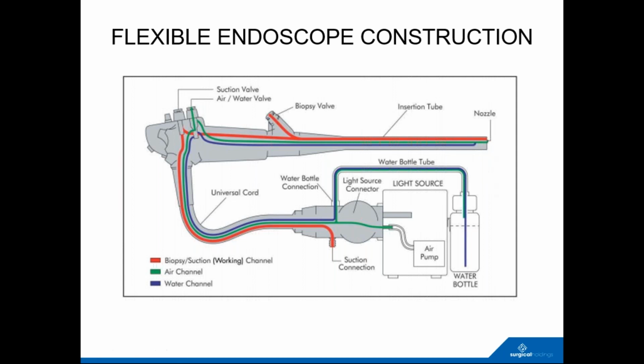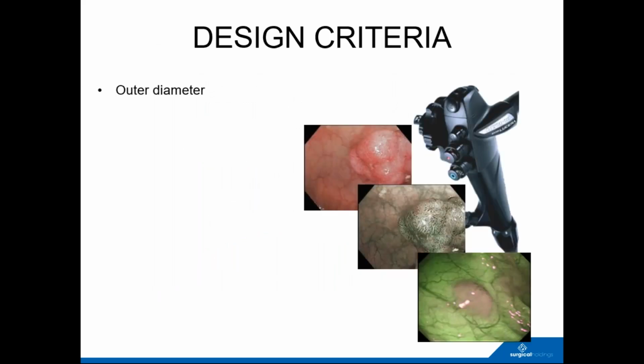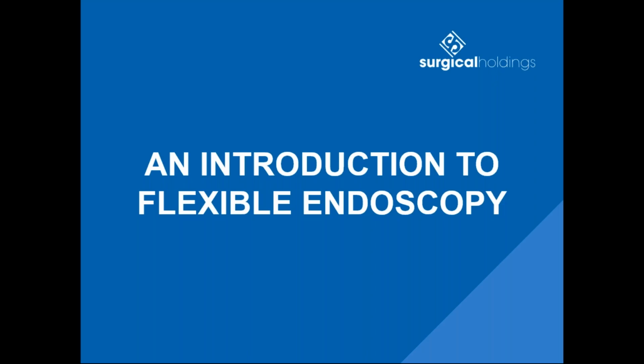Okay, excellent. Are there any more questions? I think Nick's concluded the formal presentation now, but we're happy to field some questions, so please type them in on the panel if you have any. Overall, Nick, I don't know too much about flexible endoscopes, but the complexity of them means that preventative maintenance is a must, isn't it?